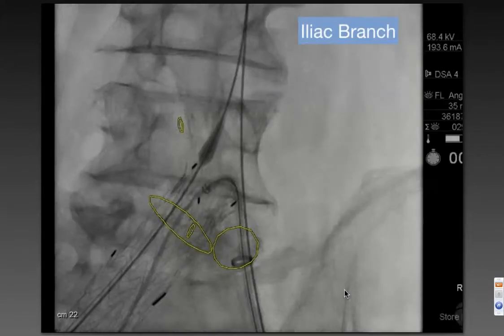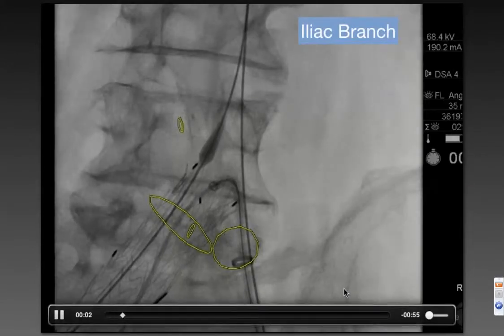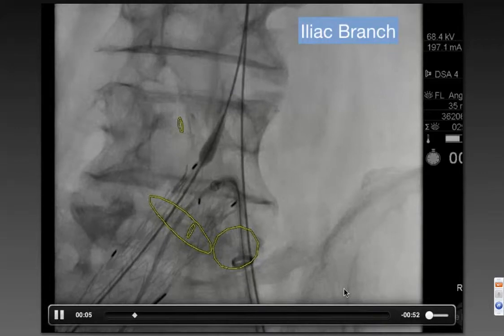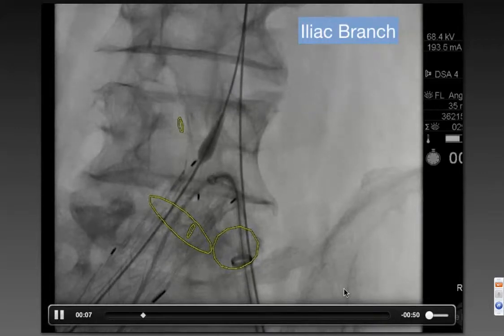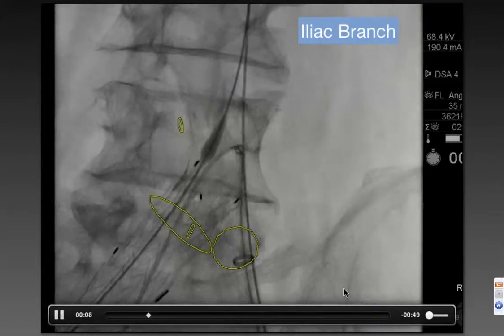Here's another even more complex type situation. This is a patient that we're putting a bifurcated excluder in the right common iliac because there's a big aneurysm there.